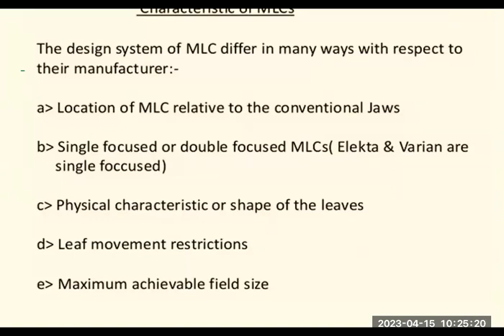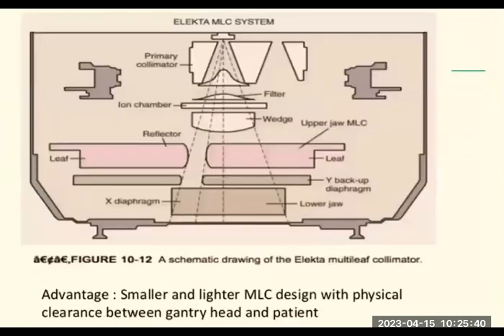By adjusting the leaves of the MLC, the multi-leaf collimator, we can fix the beam to the planned treated volume, or we can restrict the beam within the irradiated volume. So these are the three types. The first type, as we saw in the last class.